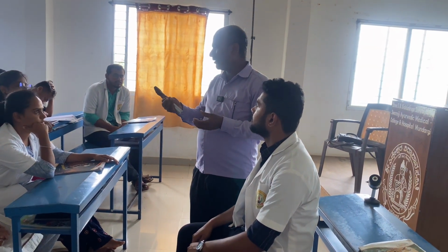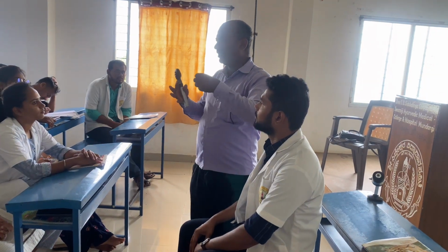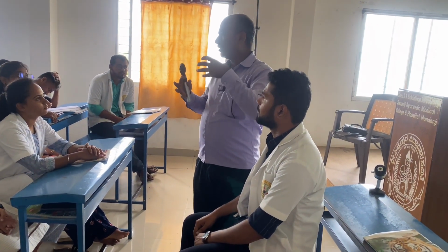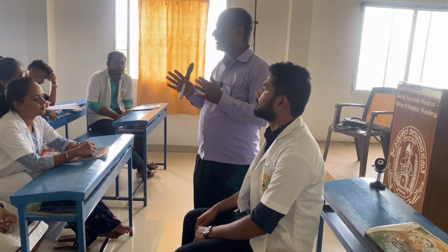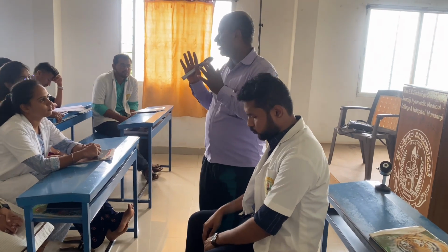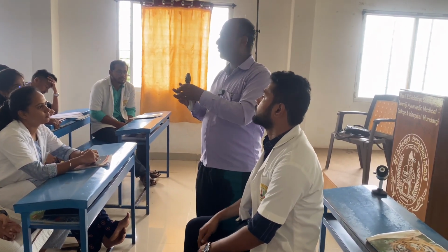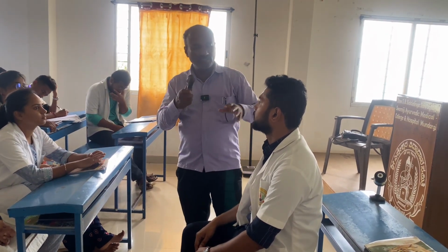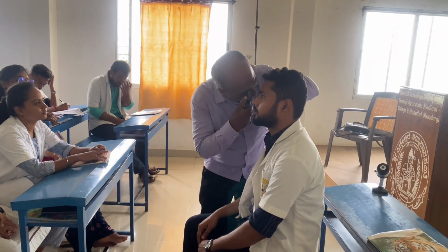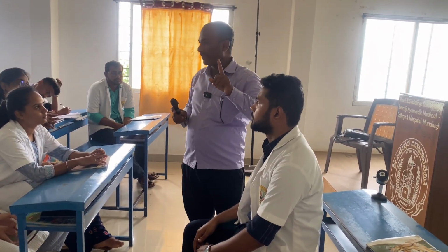It cannot decrease at all. It can keep increasing, because there might be some external pressure which has made them spread away, or death of neuroglial cells and the supporting cells in the optic nerve, that makes the optic disc and cup increase, right? So this is the method, to be done like this: go inside and first trace the optic disc and optic cup.